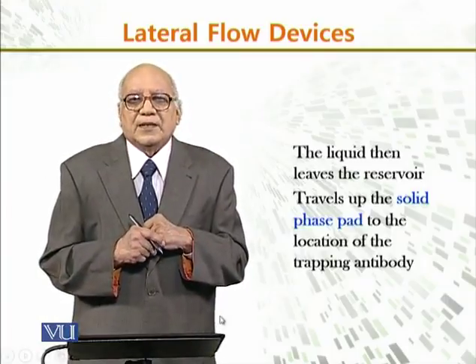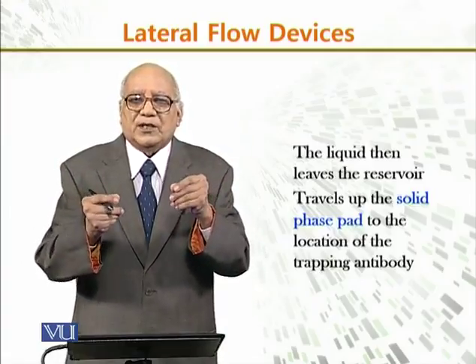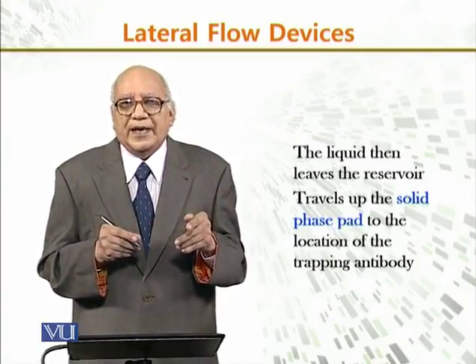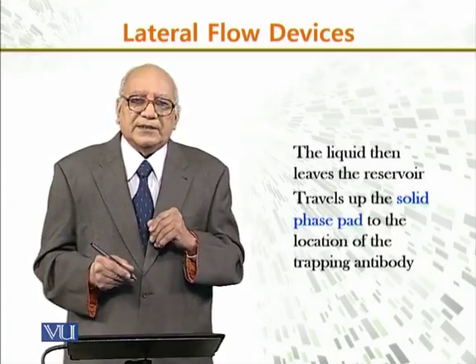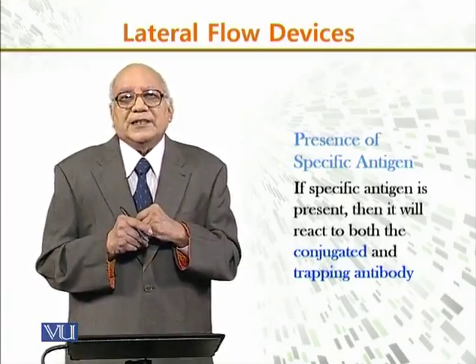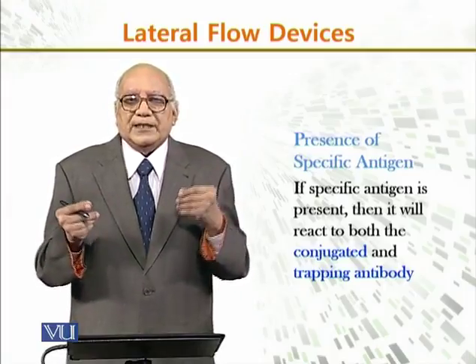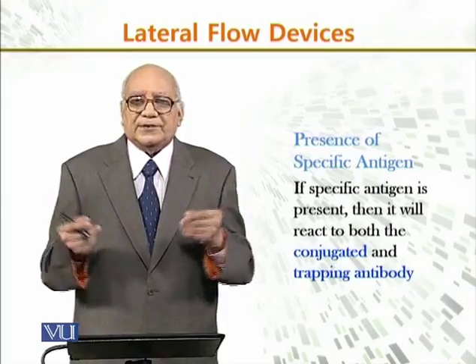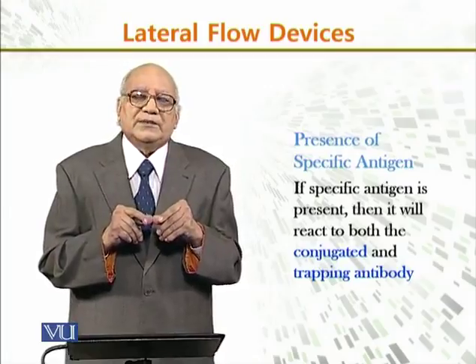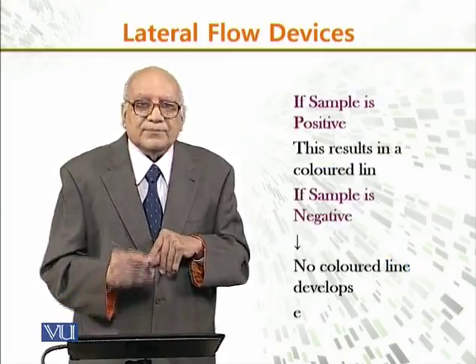The liquid then leaves the reservoir and travels up the solid phase pad to the location of the trapping antibody, testing for the presence of the specific antigen. If that specific antigen is present, it will react with both the conjugated and the trapping antibodies.